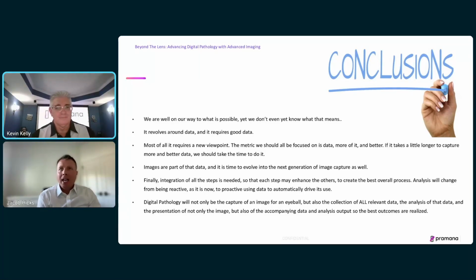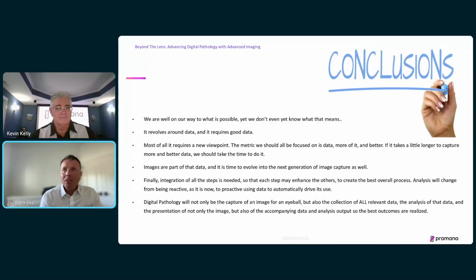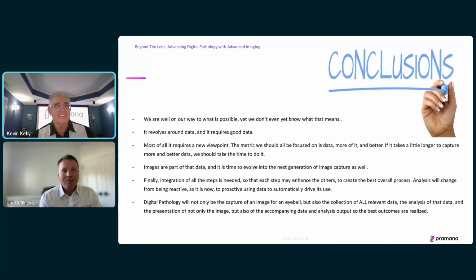Wonderful. Cass asked, I saw examples of transmitted light scanning. Is there a fluorescent light application as well? So I love that question. I used to work a lot with fluorescence. So volumetric scanning and fluorescence works very, very well. Fluorescence already looks three-dimensional when you look at it. If it's set up right with good exposure times and not a lot of background, it's stunning to look at. And when you get to the third dimension, you add a lot into it.